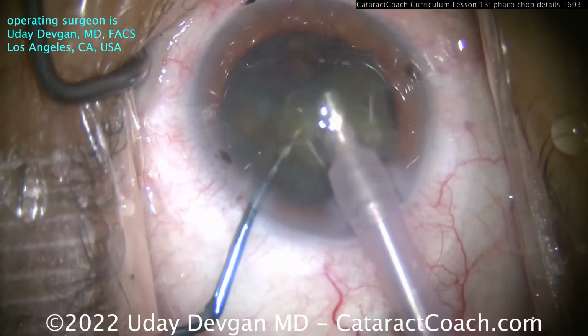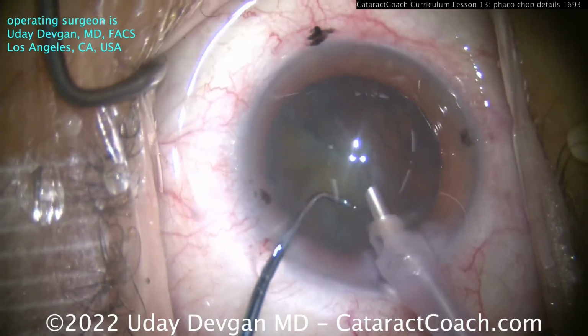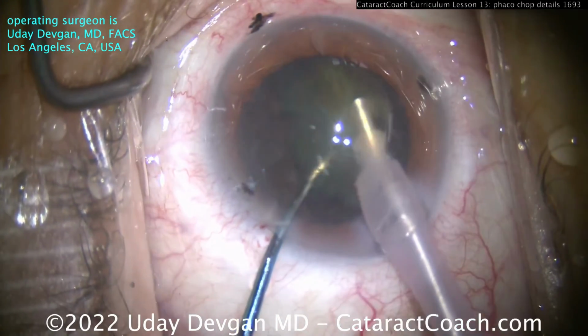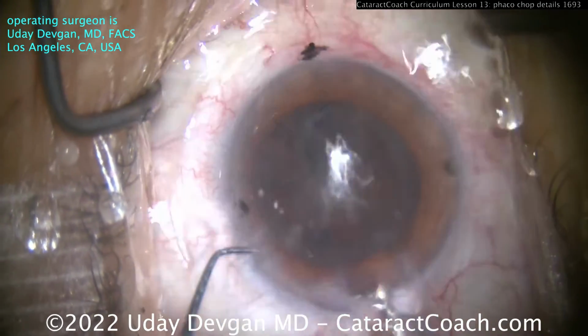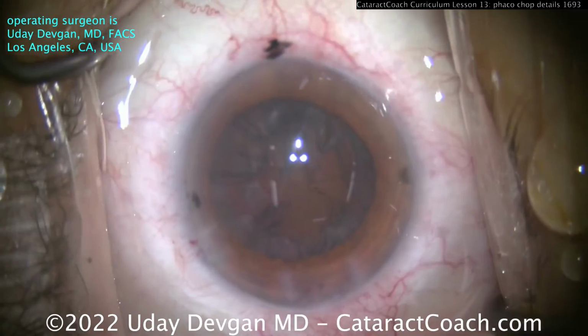You can simply occlude the tip, use the ultrasonic energy to help break it up, and just like that, one nuclear half is gone. Second half comes up out of the bag, and same concept, no further sub-chopping is really needed. So just one chop is all it takes, and just like that, the nucleus is out, and we're done. So that's kind of the trick behind it.